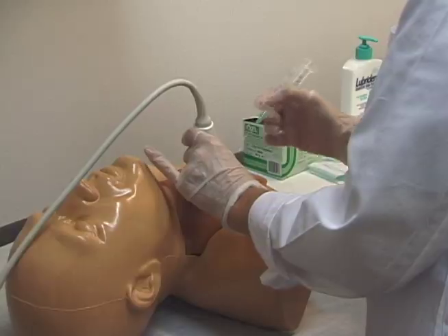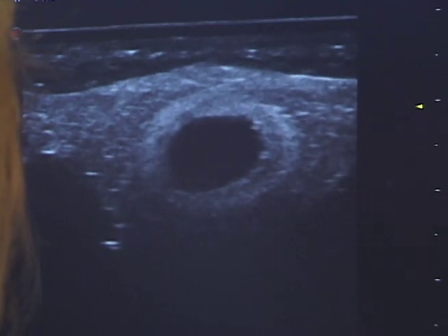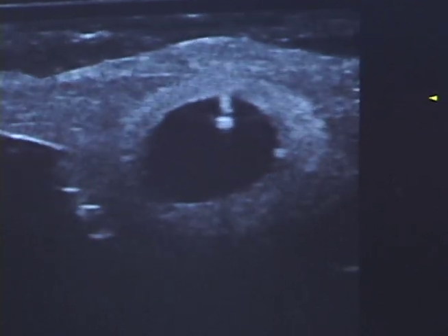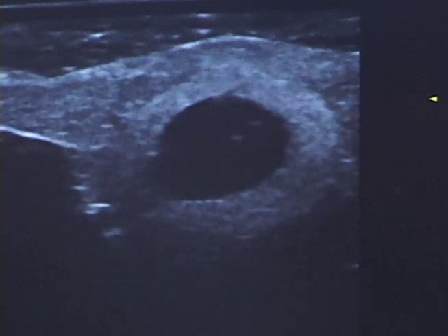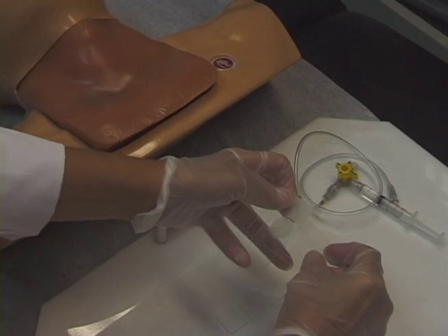I'm here today with Dr. Kathleen Hanz, a clinical thyroidologist from San Antonio, Texas, who is here for my three-day master's classes. We are going to start by learning the technique of needle placement and smearing, and we're going to be using ACE NeedleMe.